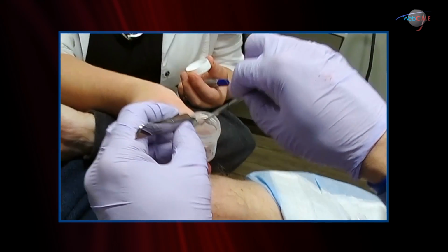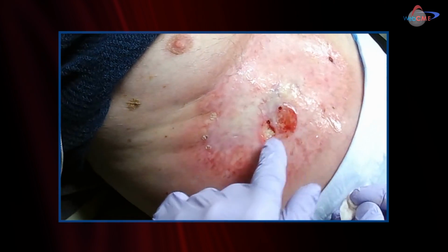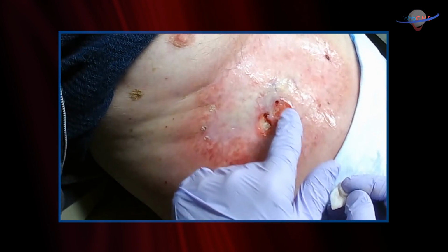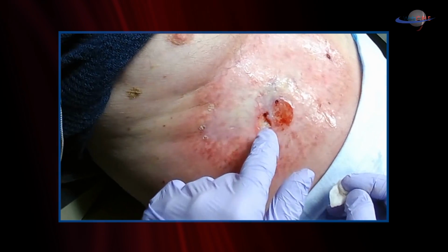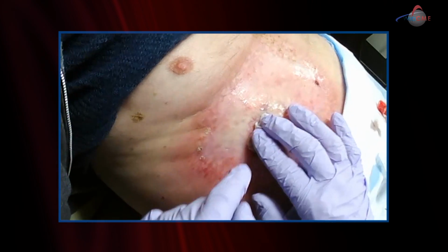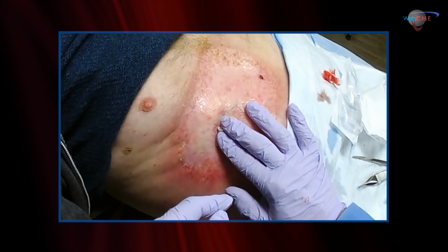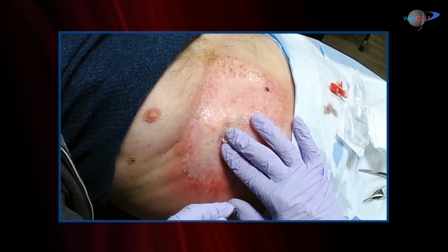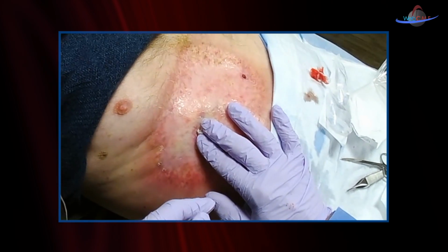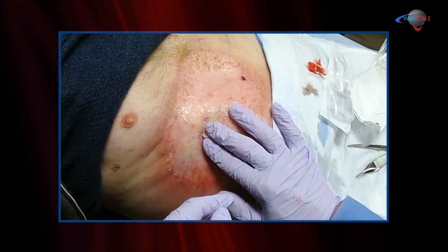And you can see how we've accomplished the biopsies. Again, straddling the wound margin, 2 sites. We'll mark this as medial wound, 1 o'clock. This is lateral wound, 1 o'clock positions. You want to annotate that on the pathology report so that the pathologists know where the tissue came from, what side of the wound. That's important down the road if it turns out this biopsy is positive. And we're hopeful that it's not.